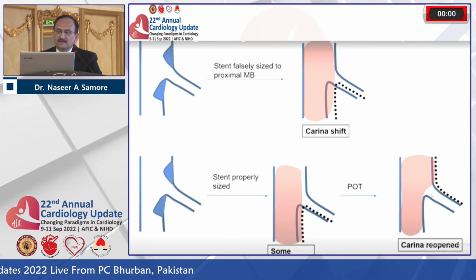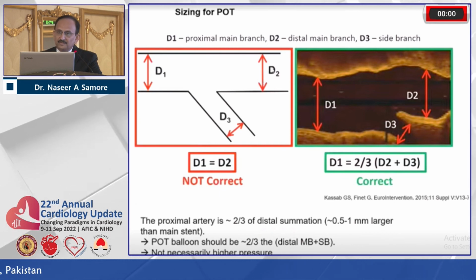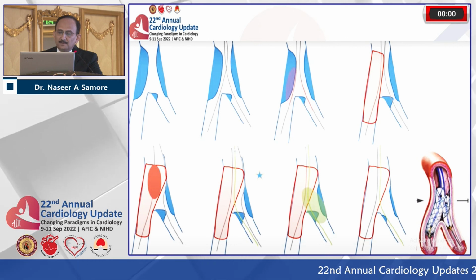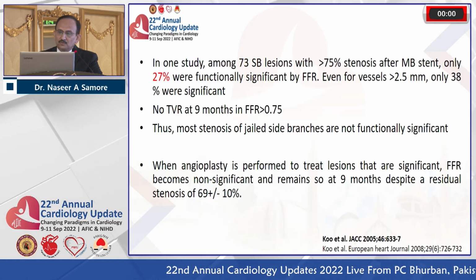These are the guidelines, and this is the guideline on how to decide the selection of the balloon for the post-dilatation. And this is an example of provisional post-dilatation. I will just quickly go through.